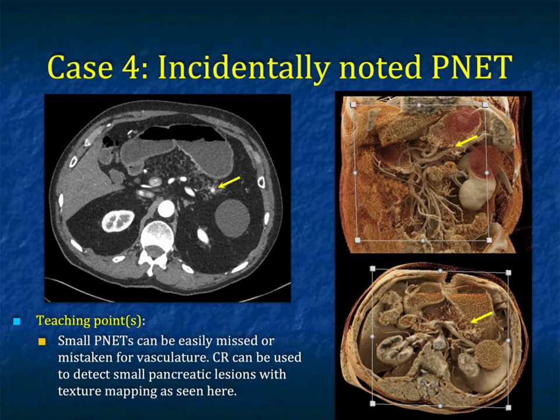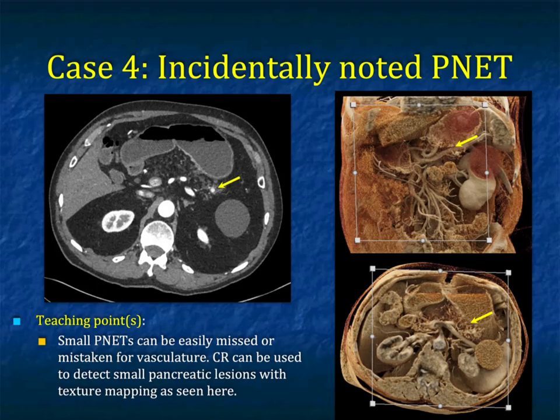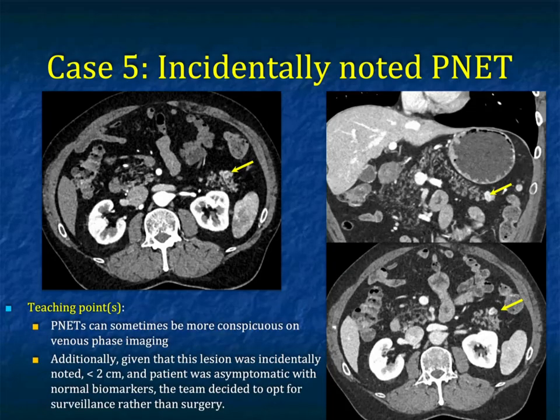Here's another case. The patient has diffuse fatty infiltration of the pancreas. You see what's basically a 5-millimeter hypervascular lesion by the tail of the pancreas, nicely shown on cinematic rendering as well. Cinematic can be very helpful for picking up these small tumors, and you can also see how easy it is to miss them.